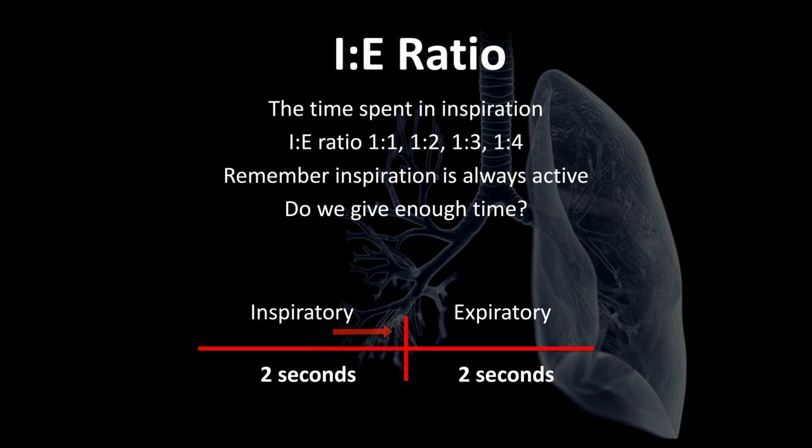And now we start seeing improvement because we have to, again, not get so tunnel vision to think that just because they're obstructive lung patients, we only focus on the expiratory phase. We should focus on both sides. We're giving equal weight. Are we getting a better overall exhaled tidal volume? We should start seeing improvement because we're allowing more time, more volume, more pressure generated to fill those lungs. Those lungs will fill based on the compliance of that patient and the lungs, currently based on their pathophysiology.